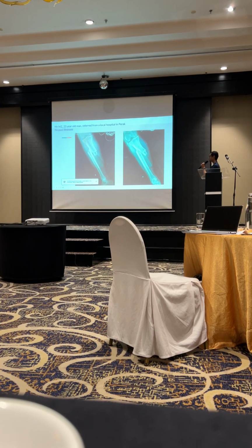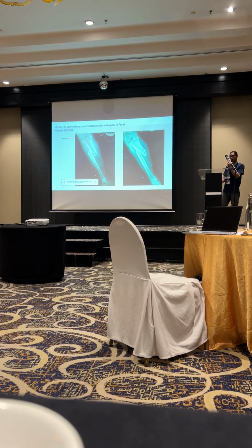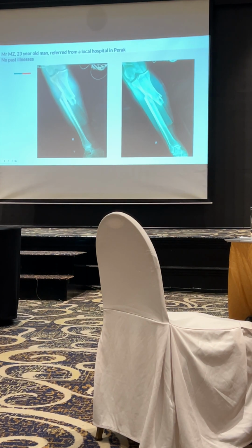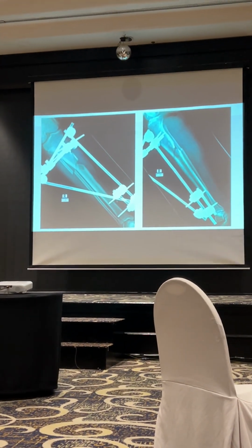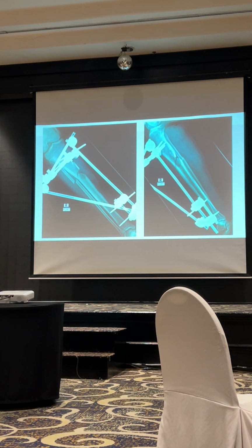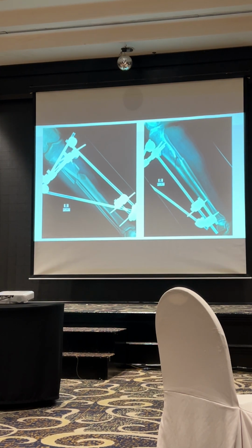He has no past illness. He had a complex tibia fracture with an open wound. Next. So the initial treatment was he was put on a temporary external fixator. Quite a good job being done, but you can see there's some amount of bone loss there. Next.